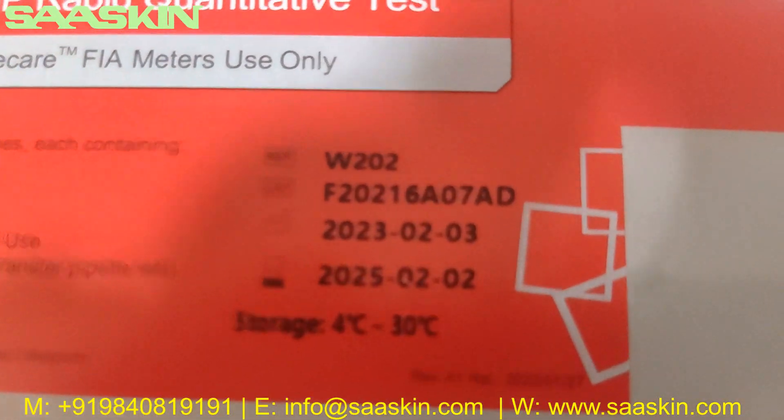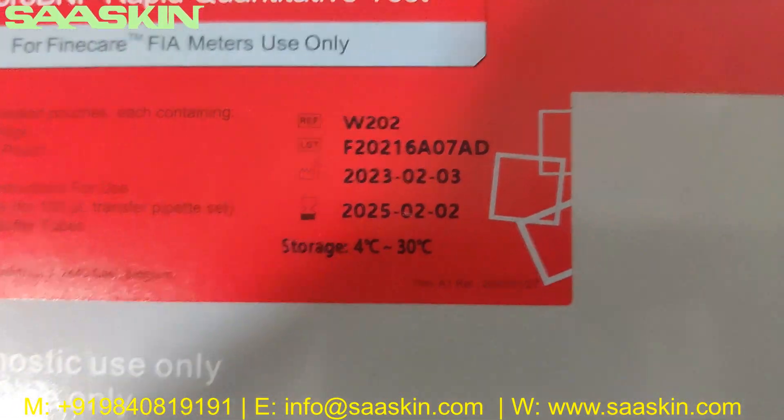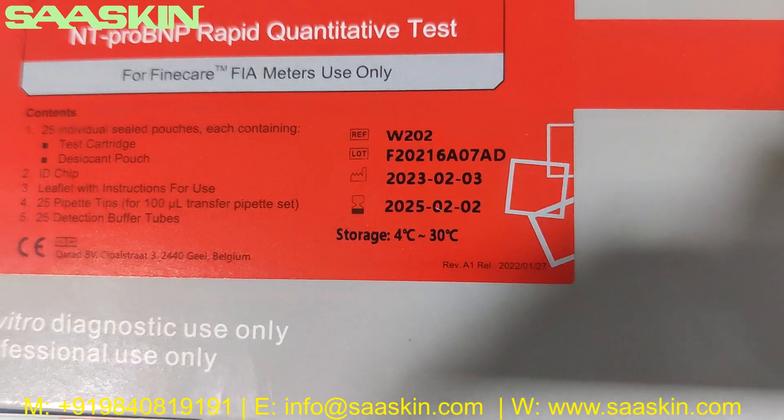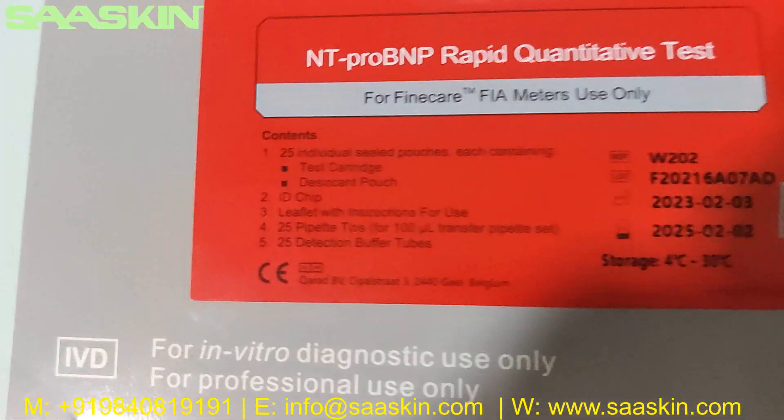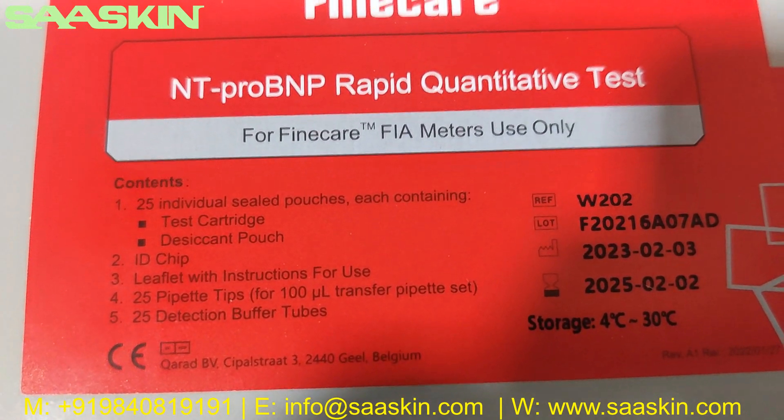If you look, this is the reference number, and you can see the lot number, the manufacturing date, and also the expiry date. You also have the storage temperature conditions — it's a room temperature condition.